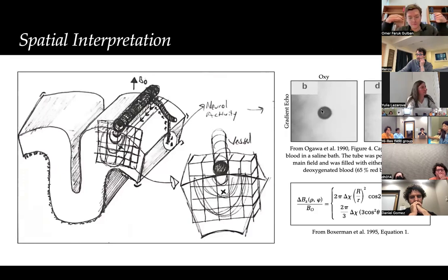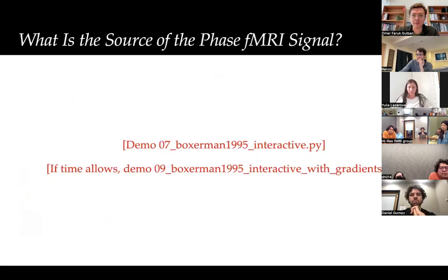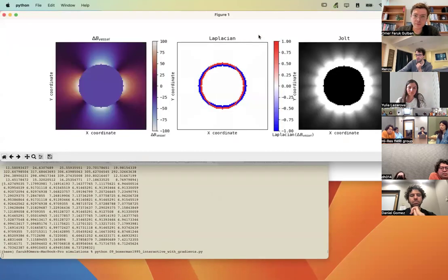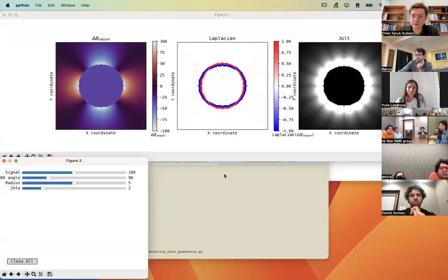And now, in the context of this ISMRM abstract and this whole discussion about phase spatial derivatives, we need to think of these images, but not only them, but their spatial derivatives. But this is quite complicated. So I try to tackle this problem by making another simulation that hopefully will give you some extra idea.